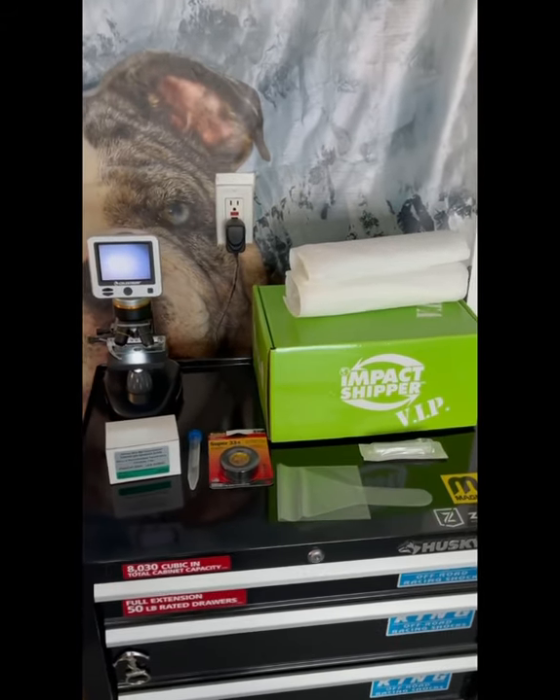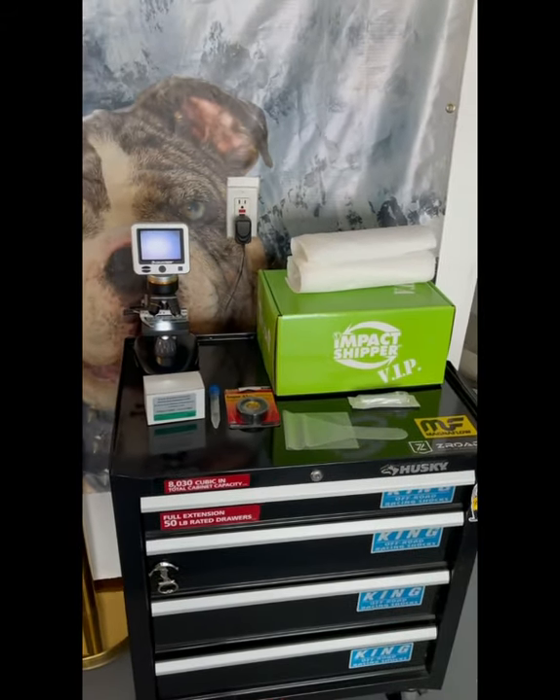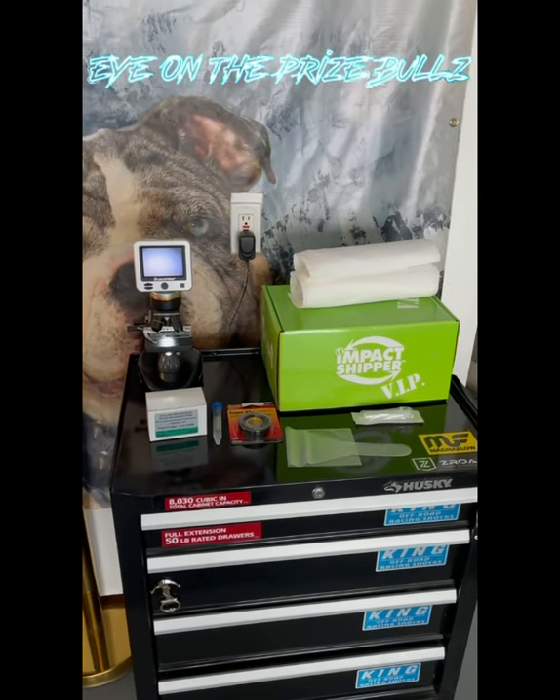This is Eye On The Prize Bullz and today's video is going to be on how to collect, prepare and ship semen.